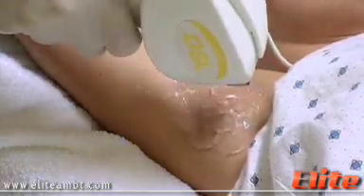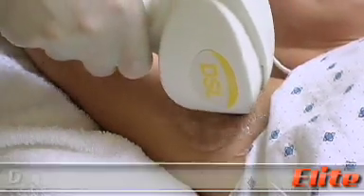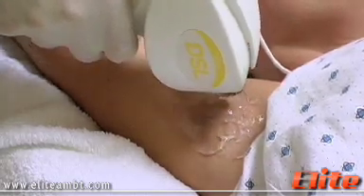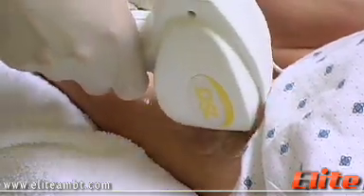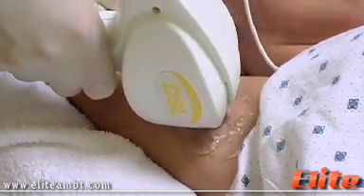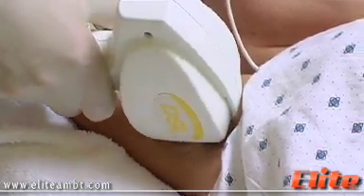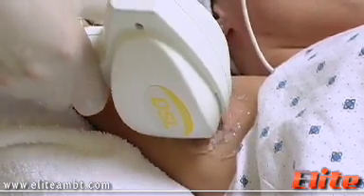After we applied a thick layer of gel, we're going to do the laser hair removal on the armpit of our model. We are using the DSL applicator of Cineron. This utilizes ELOS technology which combines a diode laser with radio frequency. It's one of the only applications that can permanently remove lighter hair colors because of the two energy sources.